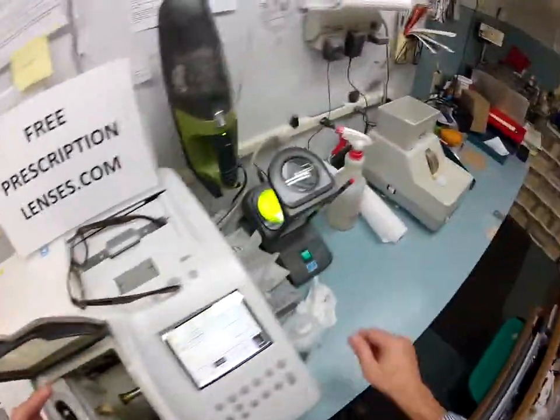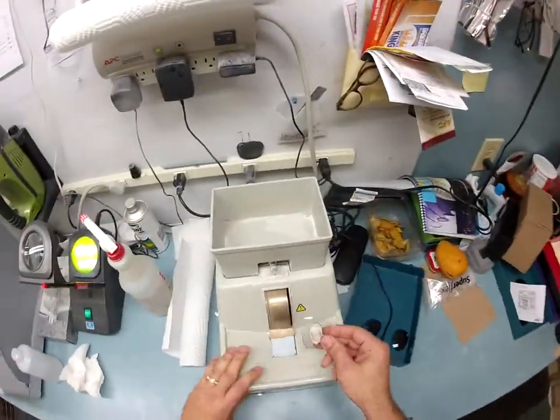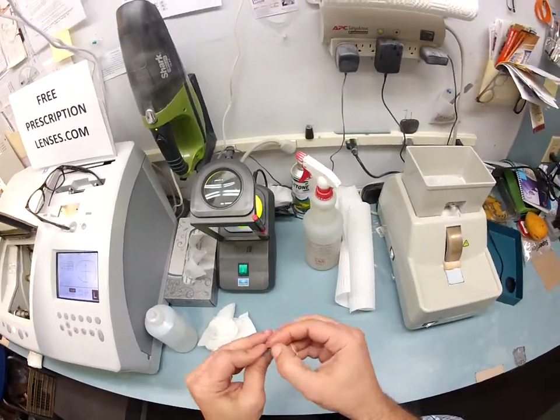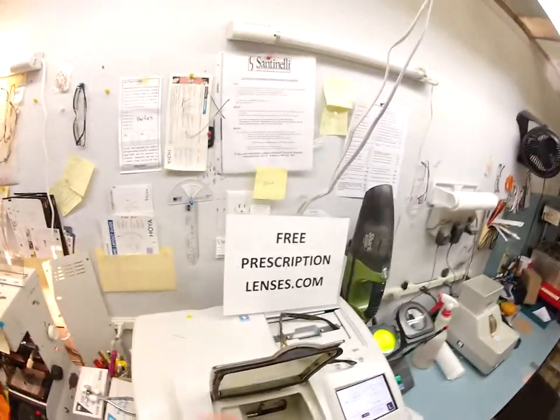Hello, is this on? Okay, hang on. Let me dry this off again. Now, back to the handstone. Back to the safety bevel. Back to the occupational thumbnail, scraping the swarf off. And this time, get it all on the counter. And this time, behind the back. Woo, look at that technique. Kids, how many times am I going to tell you?